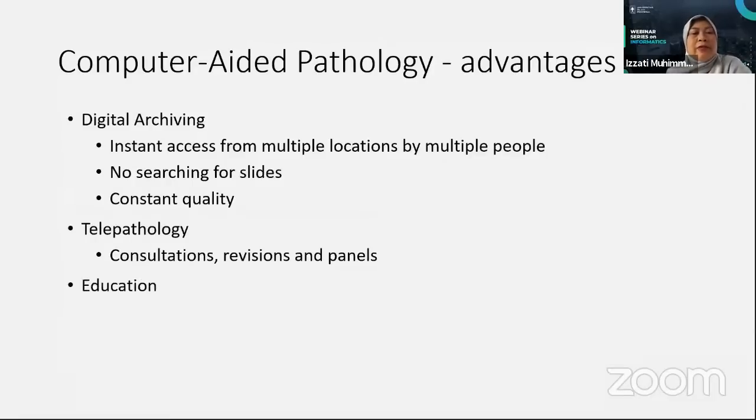And then it will serve education. The students will be happy if they know the image they see is very high quality, not one that has deteriorated, which makes them very stressed in learning digital pathology. And when it has a digital format, there are many research activities that we can do in terms of an informatics approach on that data.